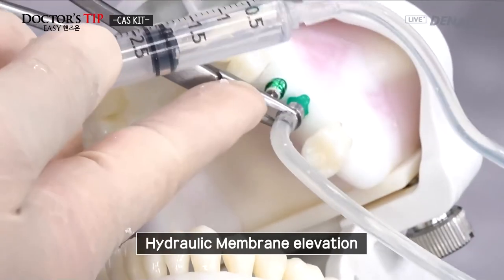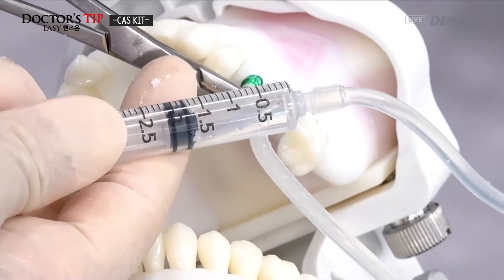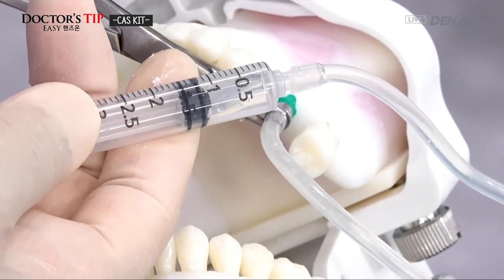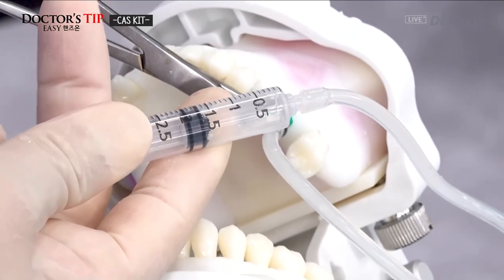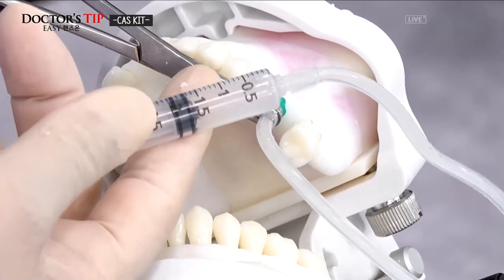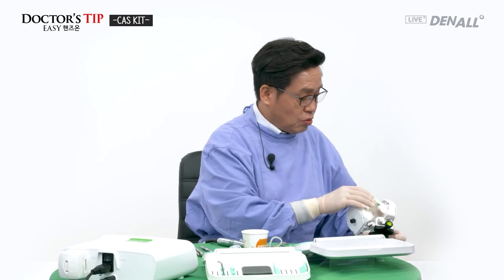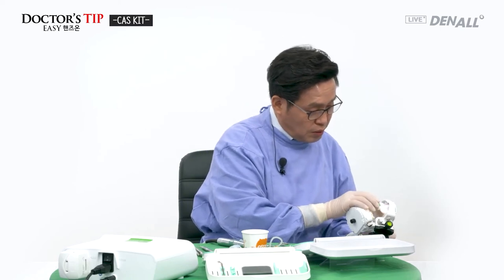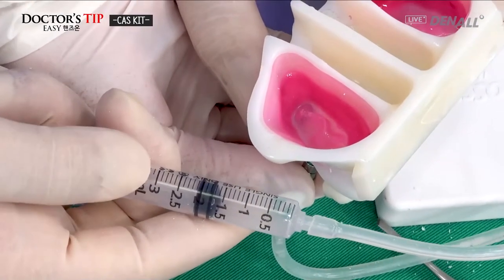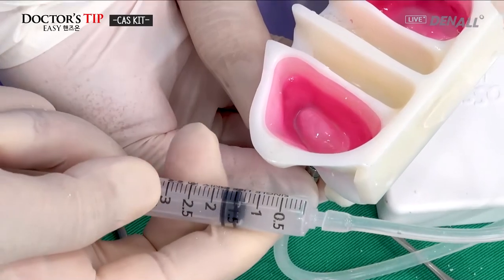Two milliliters of saline is in the syringe, infused and aspirated, infused and aspirated. Hydraulic lift is being done. Now it is lifted. Let's have a look at how it is lifted by removing this model. The mesial fixture is placed. When you do the hydraulic lift, you can see the membrane is being lifted.